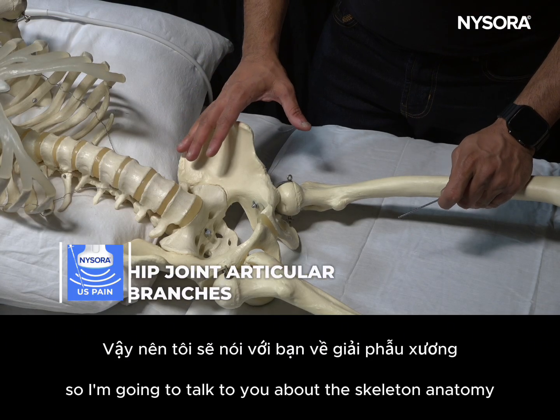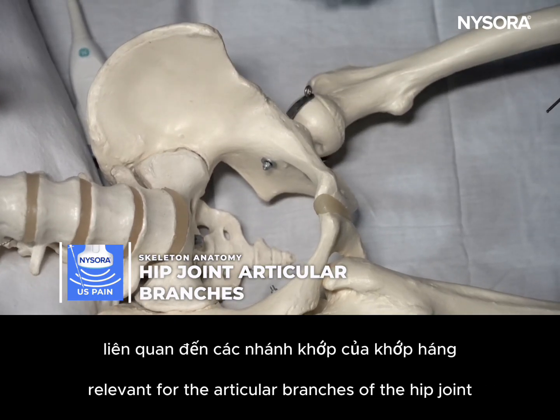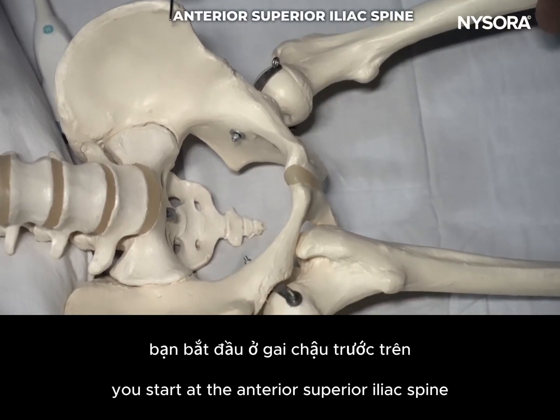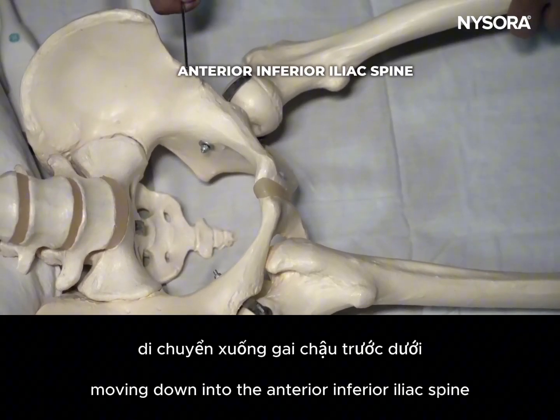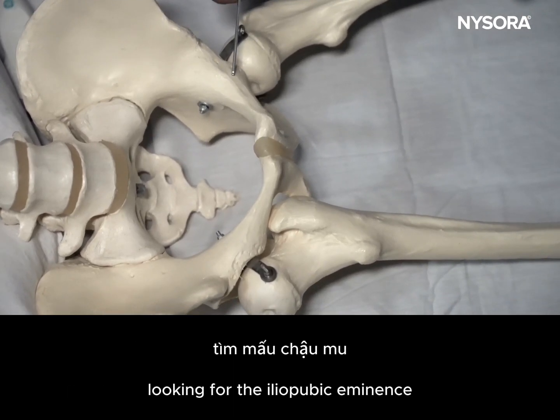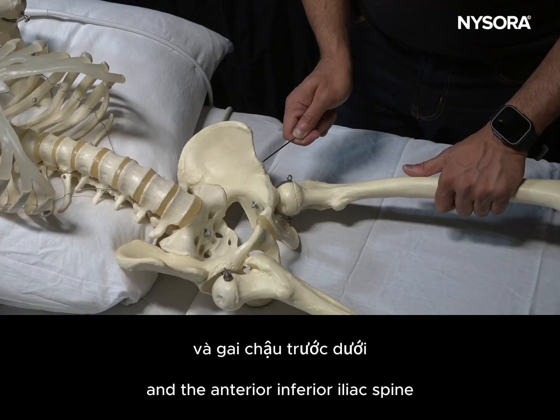So I'm going to talk to you about the skeletal anatomy relevant for the articular branches of the hip joint. To scan the hip joint articular branches, you start at the anterior superior iliac spine, moving down into the anterior inferior iliac spine. Once you look for the anterior inferior iliac spine, you will be turning the probe along the inguinal crease, looking for the iliopubic eminence and the anterior inferior iliac spine.